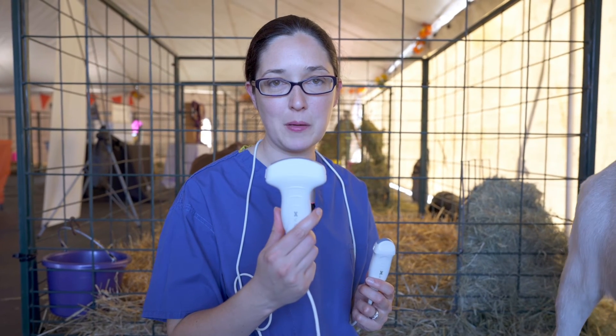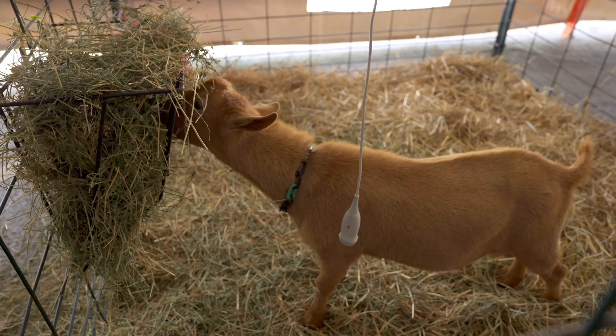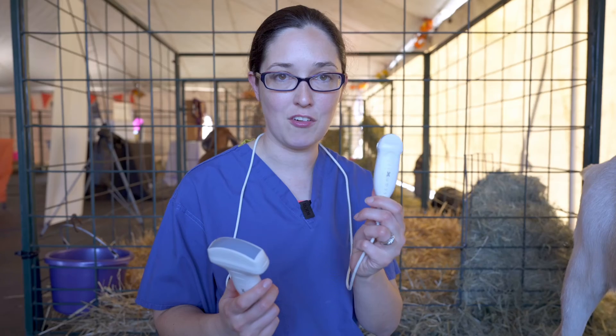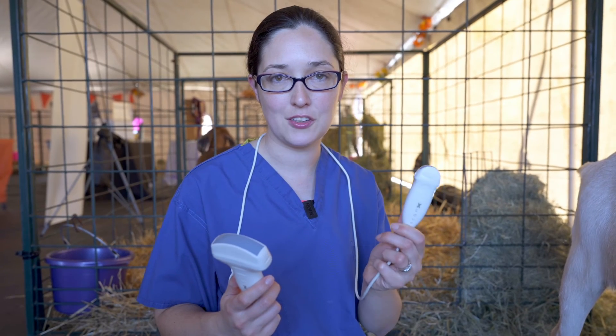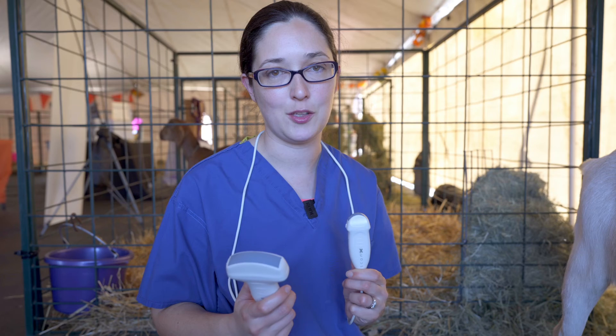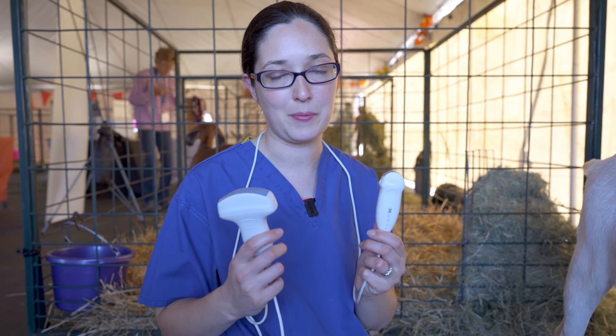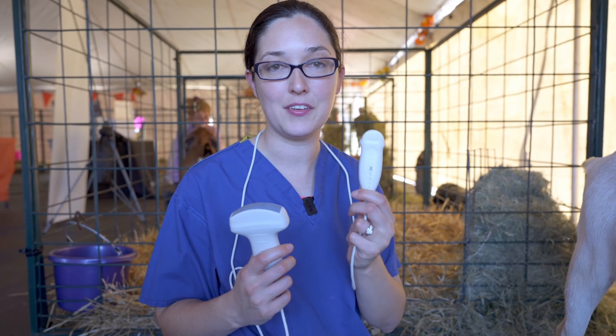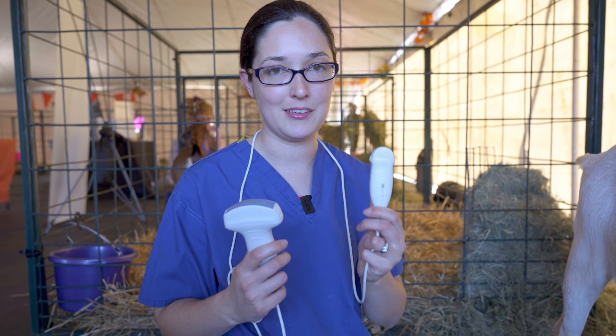For this size doe I'm going to pick a convex probe because I have good penetration with this probe. If I was scanning a Nigerian dwarf for example, I might pick a micro-convex probe. The penetration is not as good but the image quality is better, and on a smaller goat this would be more appropriate. It's also a lot more maneuverable, so when you're getting back up under the leg you can move it more easily.